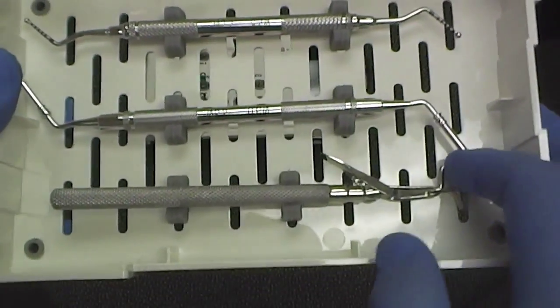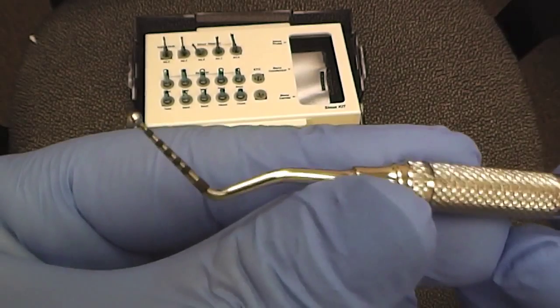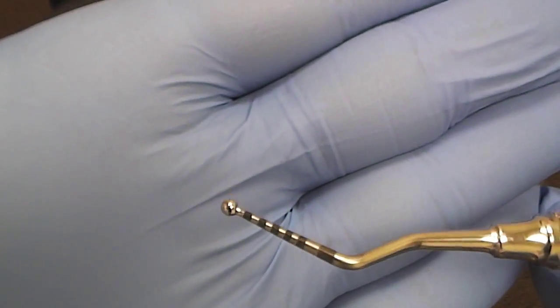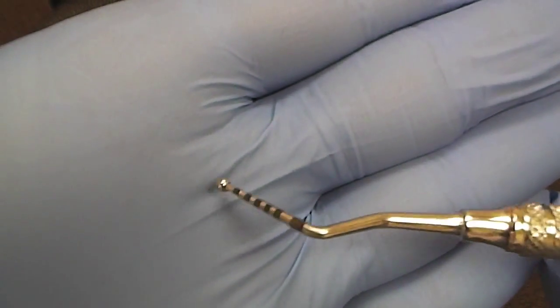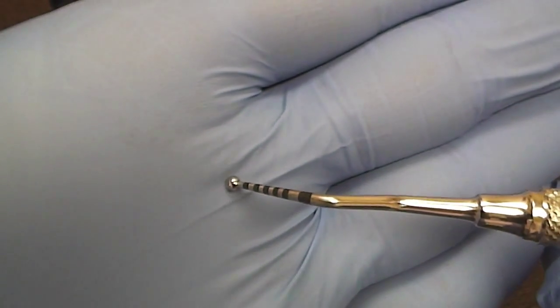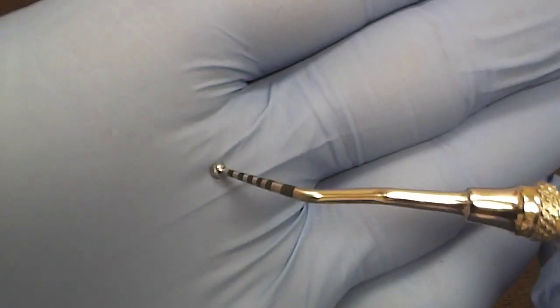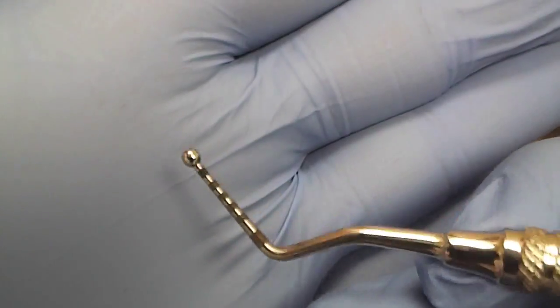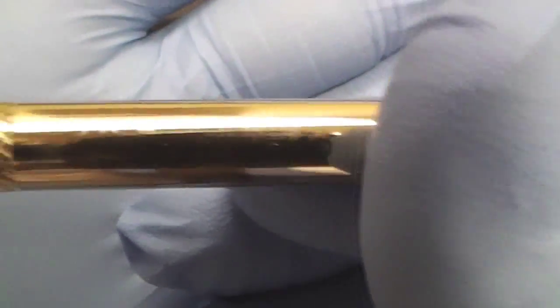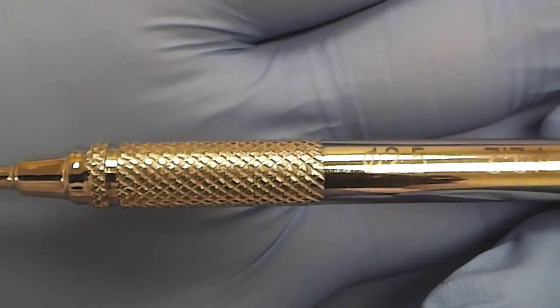The instruments that are in the base of the surgical kit have specific functions. These are sinus probes. You can see that there's a ball end at the end of each one. So you can go into the osteotomy and check to make sure that you have, in fact, not completed your osteotomy and lifted the sinus yet. If you put it in and you feel a little bit of a bounce, you'll know that you've already gotten to the point where the membrane is exposed and lifted. They have two diameters to them. One side of the sinus probe is 2.2 millimeters, and the other side is 2.5 millimeters.